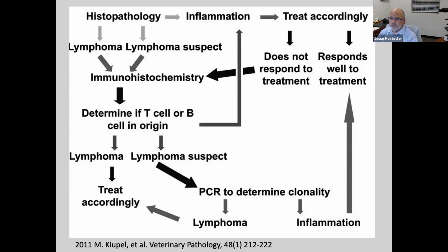The answer to your question is I have absolutely no idea. I don't think you're talking about the picture I showed, which is pretty overt fibrosis. If you did a trichrome, it would be loaded, and you've got loss of the crypts because there's so much fibrosis. That's not what I'm talking about here. I'm talking about these cats that have this funny band, almost linear through the lamina propria, and it looks like kind of a sclerotic change.